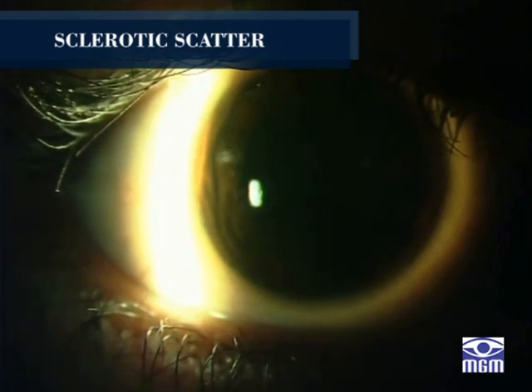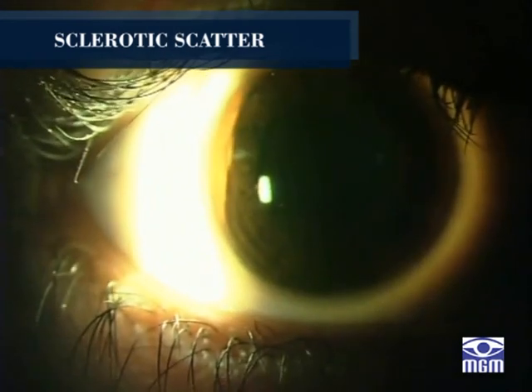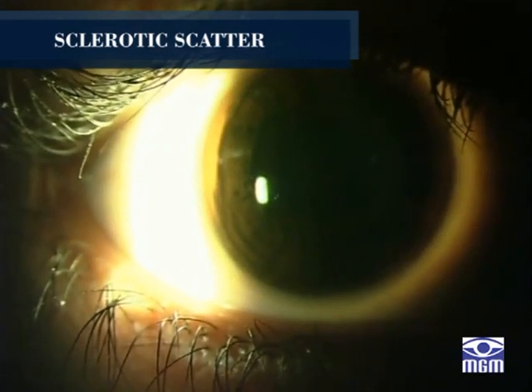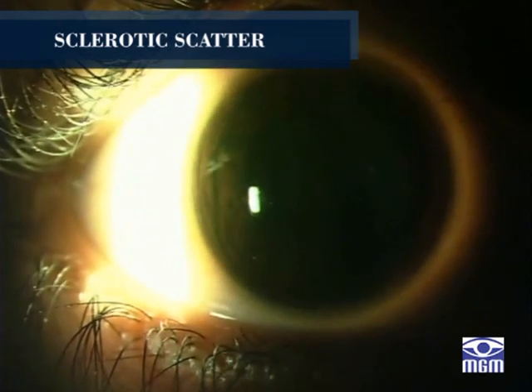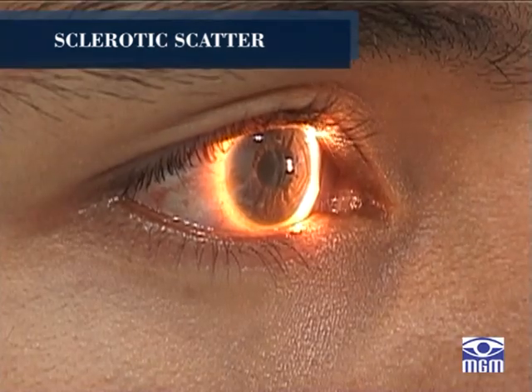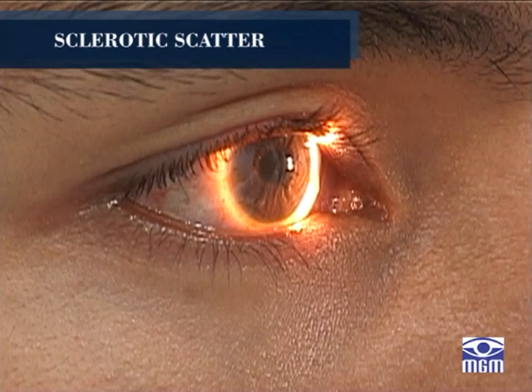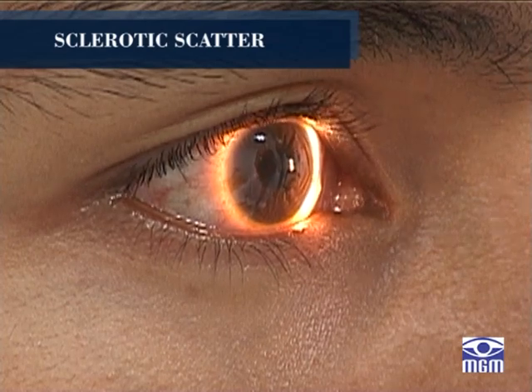In the normal cornea, this light passes through the stroma undisturbed and is visible only as a ring of light at the limbus where it intersects and is reflected by the sclera. The brightest portion of this ring of light is located directly opposite to the source. The normal cornea itself appears unilluminated.